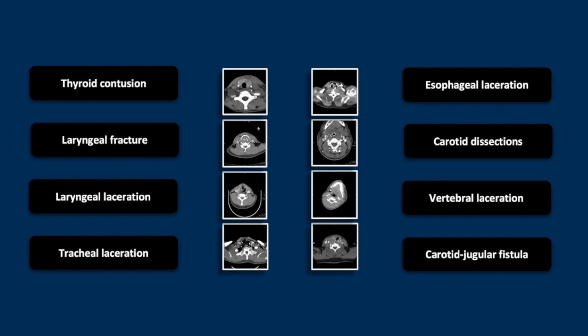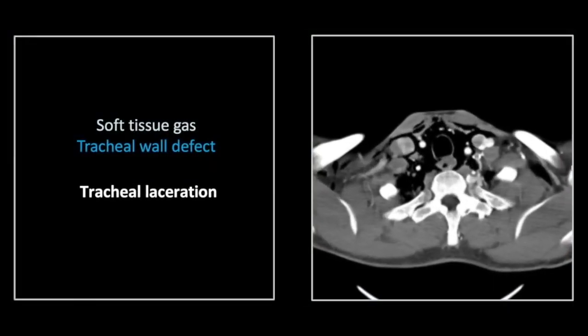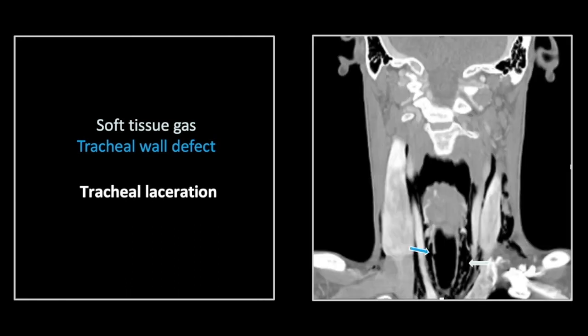Our next case is a tracheal laceration. This was a steak knife induced injury. A stabbing with a flat blade such as that can make a defect that is very difficult to spot. Your attention is directed to the airway by this extensive soft tissue gas. The defect itself is difficult to spot, encouraging you to use lung windows and to always rely on the orthogonal planes as well. Here you can see on the coronal, clearly demonstrated are the soft tissue gas and that right lateral tracheal defect.